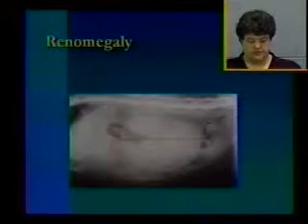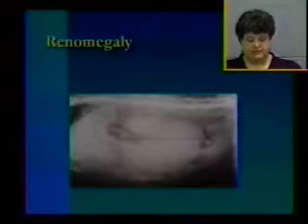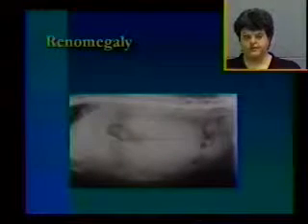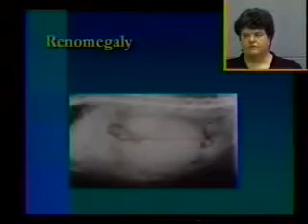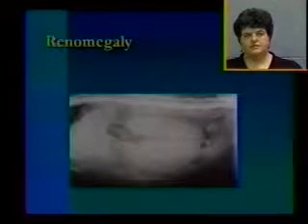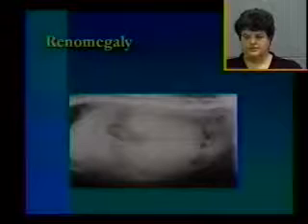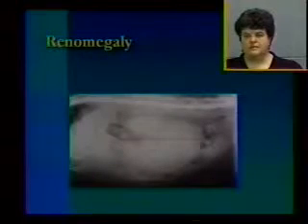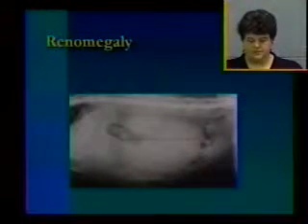This is a lateral projection of a cat abdomen. You can see one normal kidney sitting up underneath the body of L3, and then the very abnormal kidney sitting ventral to it. You can tell that this mass is arising from the retroperitoneal space, because it's ventrally displacing these small intestines. If it was on the VD, you could also see this as well, that they were being spread to either side. The next step in this case would be to ultrasound this animal to help you determine what specific abnormality is going on.